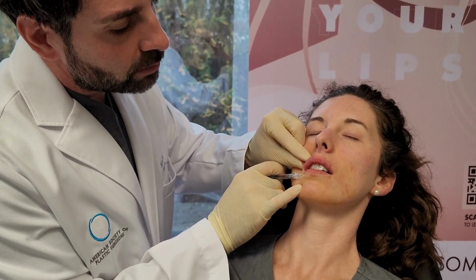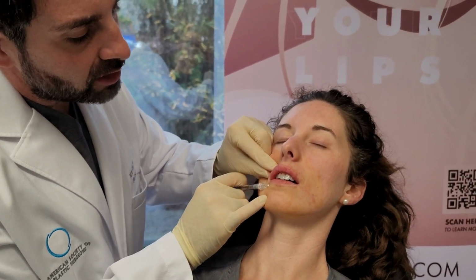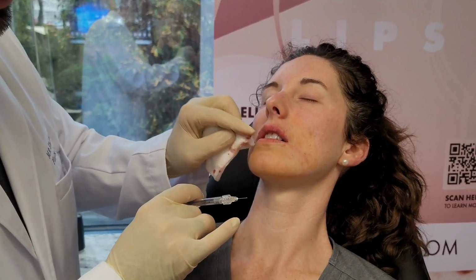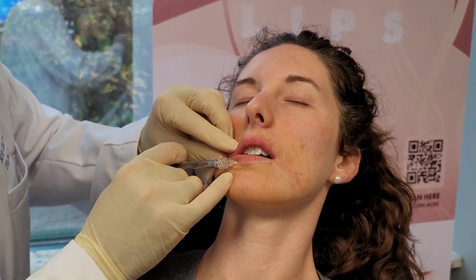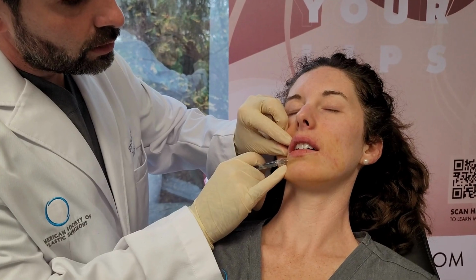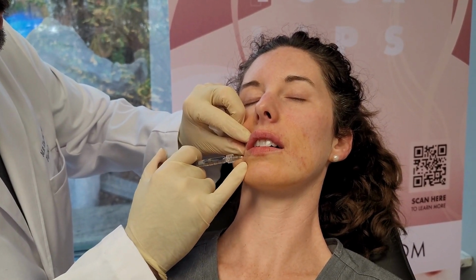We're going to put a few drops into the lower lip. Now we're going to start. The lower lip tends to be a little simpler. It's more uniform, so there's less changing of angles. It's nice to get a little puffiness in the area that corresponds to the Cupid's bow. Okay, all right, that's good for that. Let's inject a little bit more on each side. Massage it in.